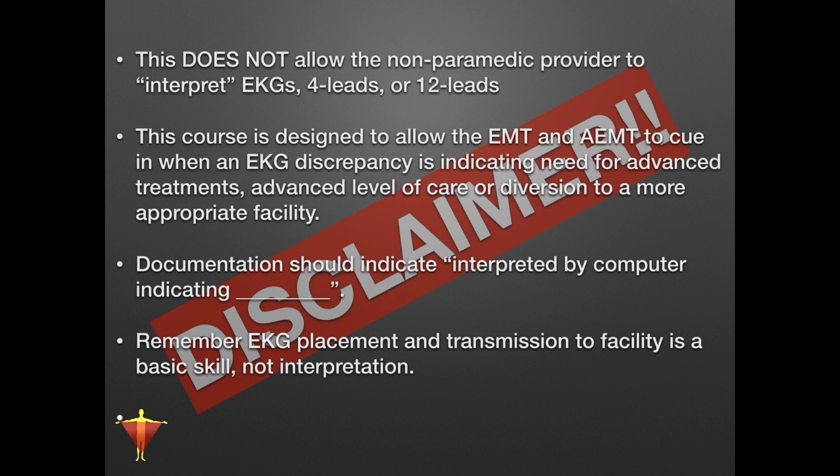But same rules apply here. This still does not allow the non-paramedic provider to interpret EKGs, 4 leads or 12 leads, right? We still can't write this into our narrative. Rather, we want everybody, whether that be EMT or advanced EMTs, to be able to cue in when we see this kind of discrepancy in our EKGs, and be able to call ahead or alert a facility of what's going on with this patient.